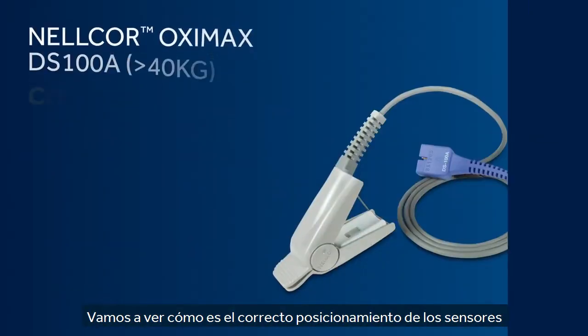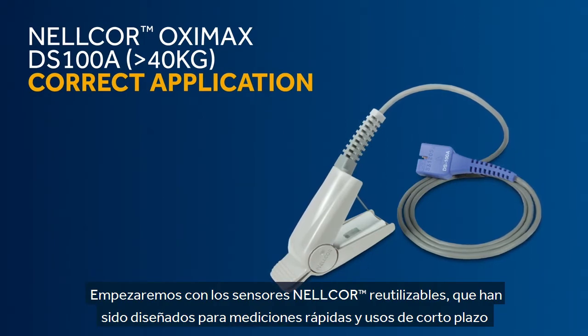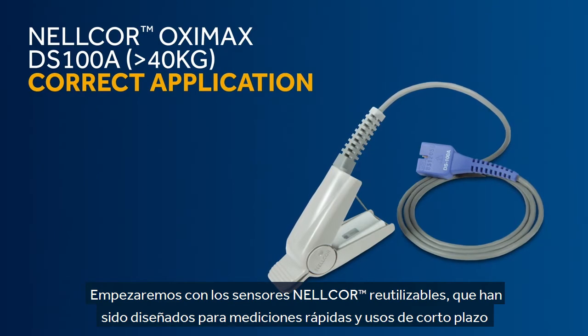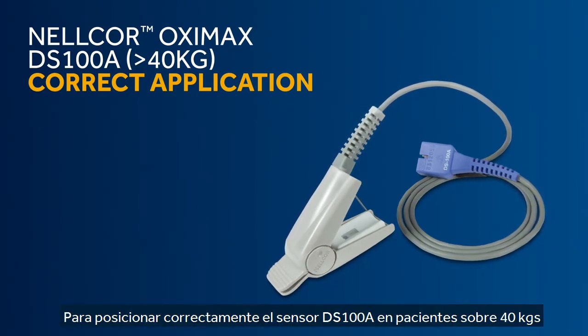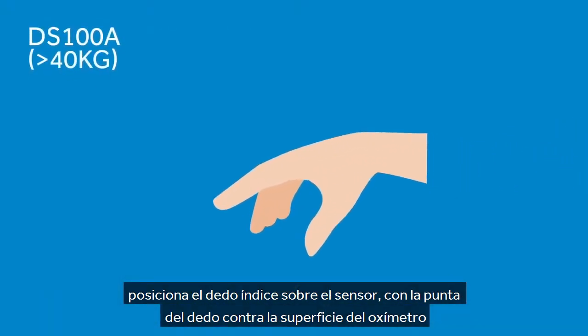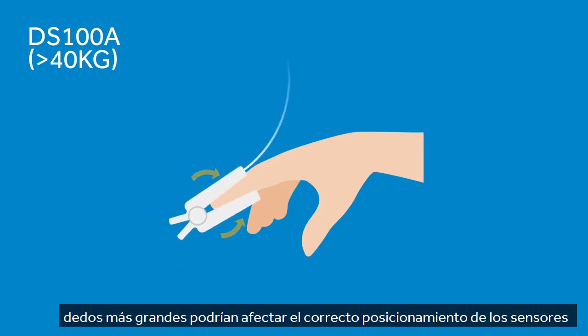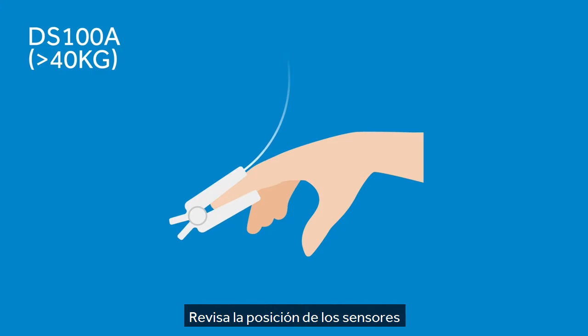Let's take a look at correct sensor application, starting with the Nellcor reusable sensors, which are designed for spot check and short-term use. To correctly apply the DS100A on patients over 40 kilograms, place an index finger over the sensor window with the fingertip against the finger stop. Longer fingernails may affect correct placement of the sensor. Check position of the sensor.